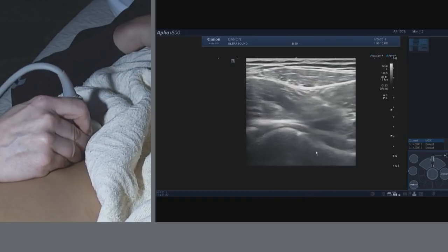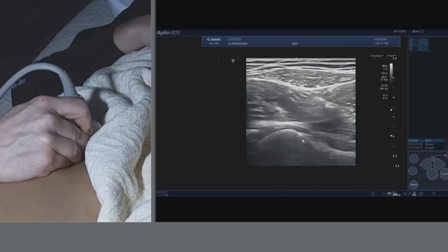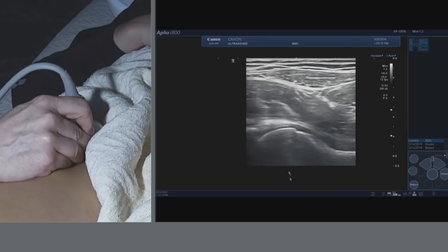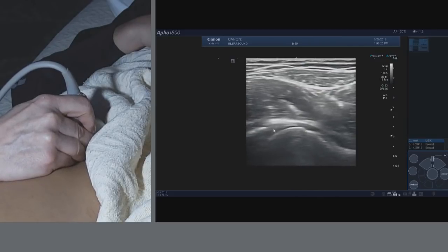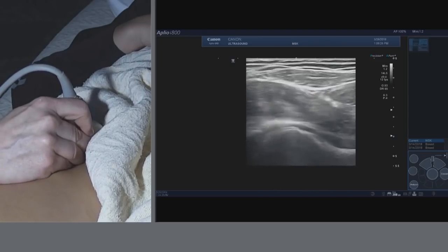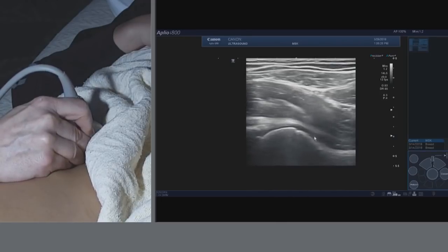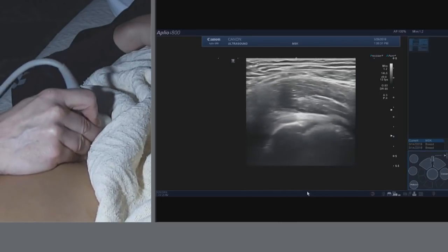So when we talk about cam-type impingement, we know that this can be an indirect sign, but we also know that this finding can be seen in asymptomatic people. So I would look at this, I would look for a labral tear. My clinician would then correlate clinically for femoroacetabular impingement. The model here is asymptomatic, but she is an athlete, so this could relate to that.